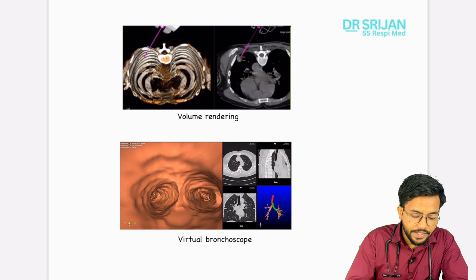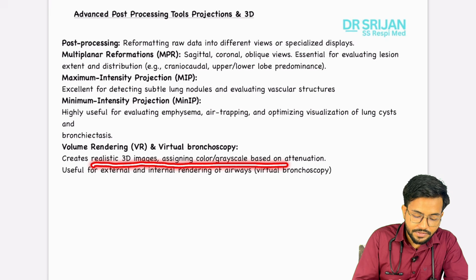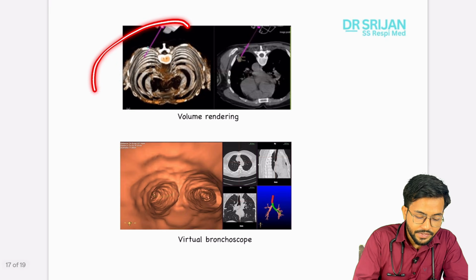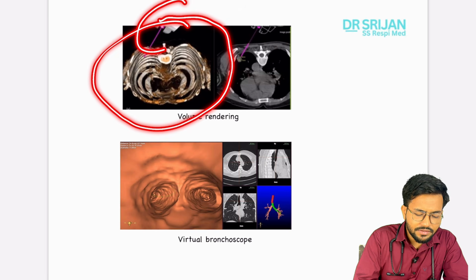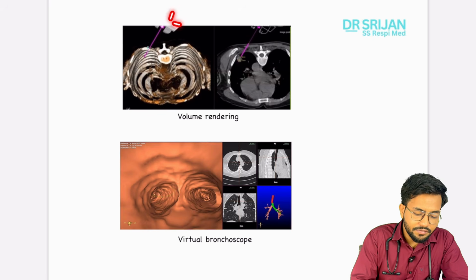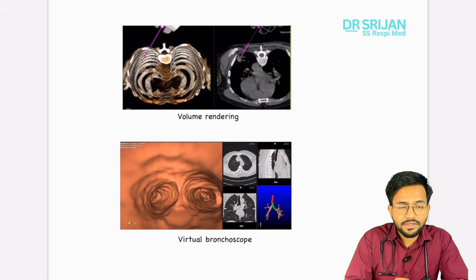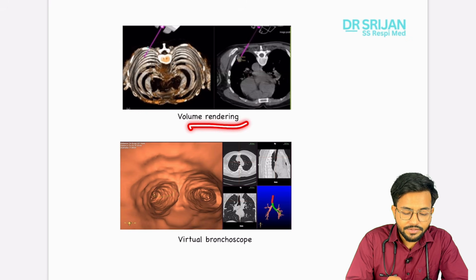Now, what is volume rendering? Volume rendering is to create a realistic 3D image, something like this. We are creating a realistic image. It does not have much use. The only simple thing is that we mainly use this for navigational biopsies. This is what volume rendering stands for.